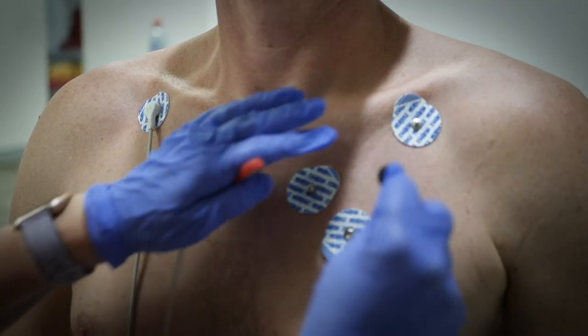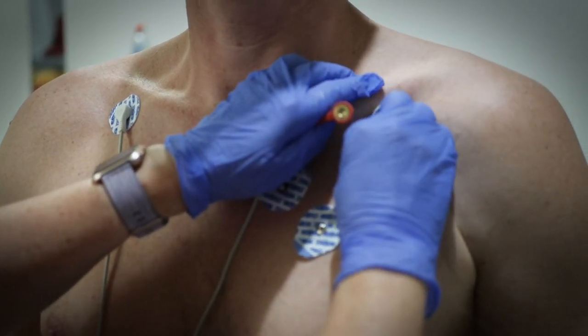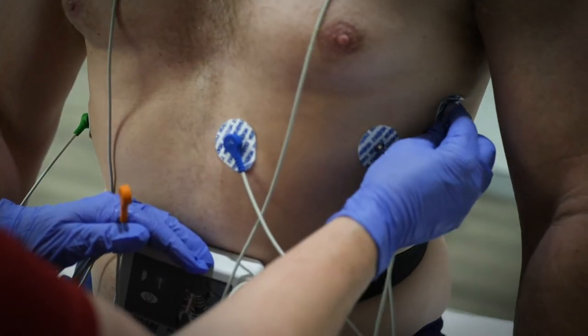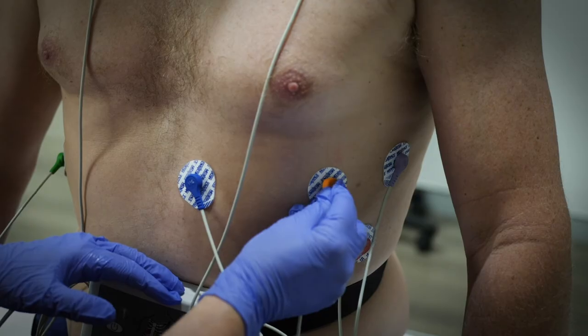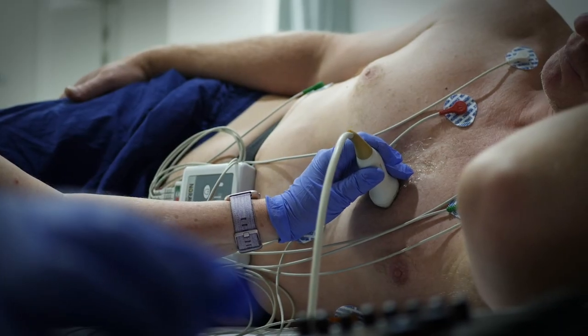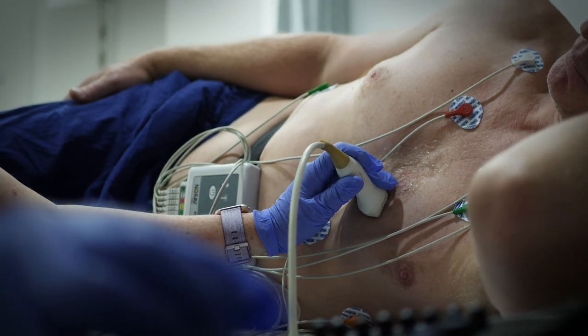We will connect 10 sticky electrodes to various parts of your body. These sites will be cleansed first with alcohol wipes. Some men require a small amount of shaving to ensure good electric contact between the electrode and skin. The electrodes are connected to the leads to provide signals for the ECG to record.